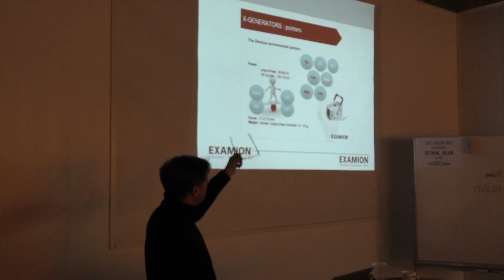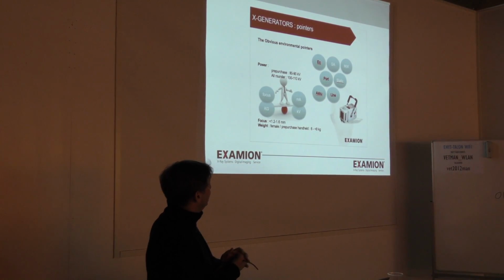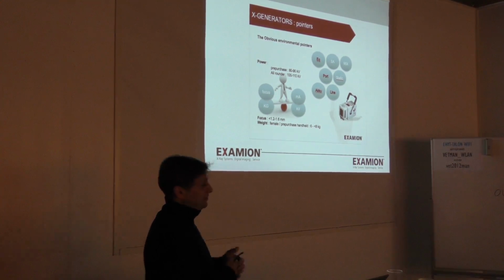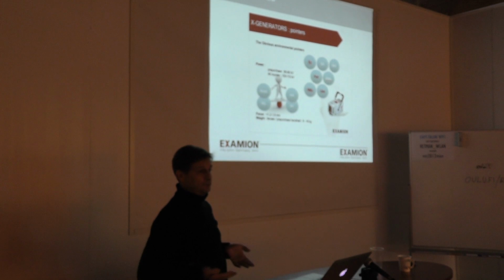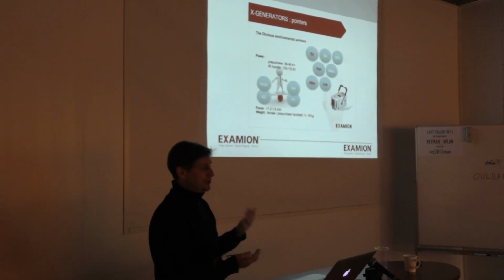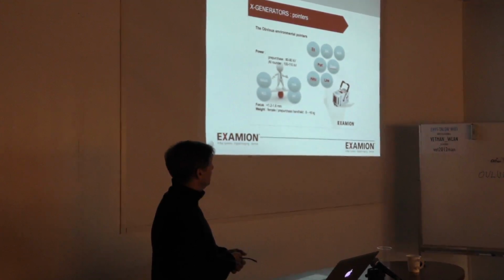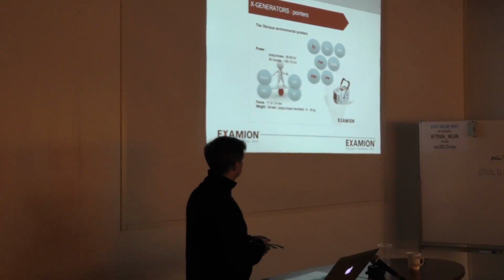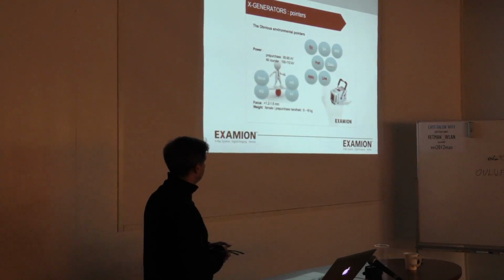And here you see on the diagrams, I've put in, for example, EQ is from equine, it could be also small animal. In case you need a portable one, even also for surgery rooms, for example, you would take a portable one, take a cassette into the surgery room, and actually, during the operation, take some X-rays. So there you need a portable solution as well. Could be battery operated, power operated, and then you see the little balance. Then you see, okay, what to decide now.